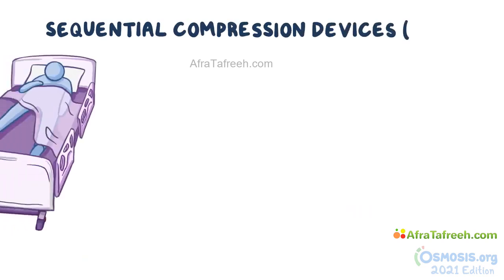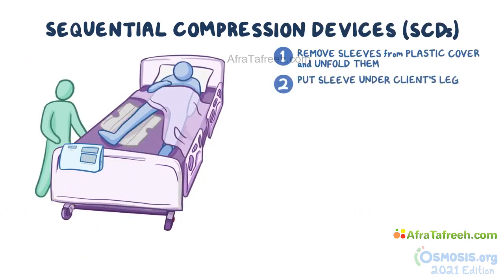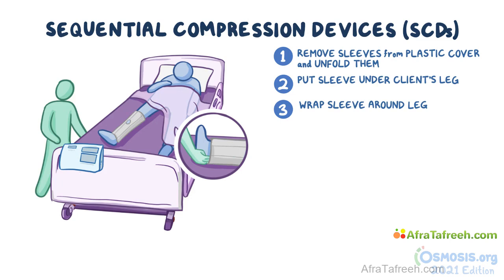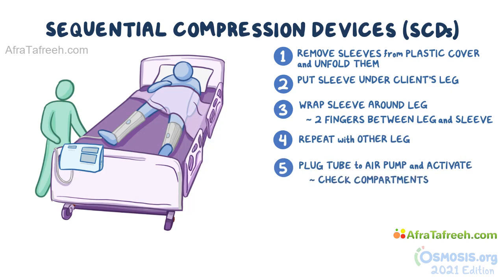Now for the SCDs. Remove the sleeves from the plastic cover and unfold them. Put one sleeve under the client's leg so the ankle lines up with the ankle opening and the back of the knee with the knee opening. Wrap the sleeve around the leg and make sure it fits correctly — you should be able to fit two fingers between the leg and the sleeve. Repeat on the other leg. Then plug the tube into the air pump and activate it; a green light will typically turn on. Check that the compartments are properly inflating and deflating for a full cycle.